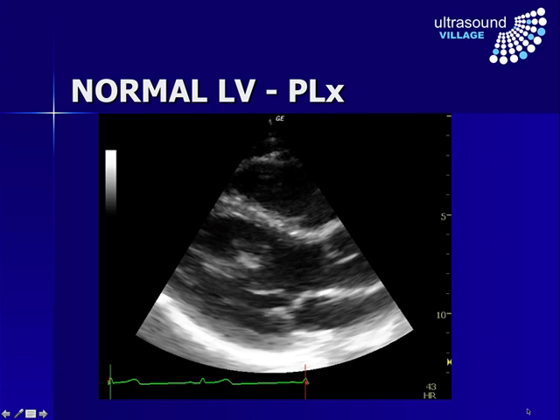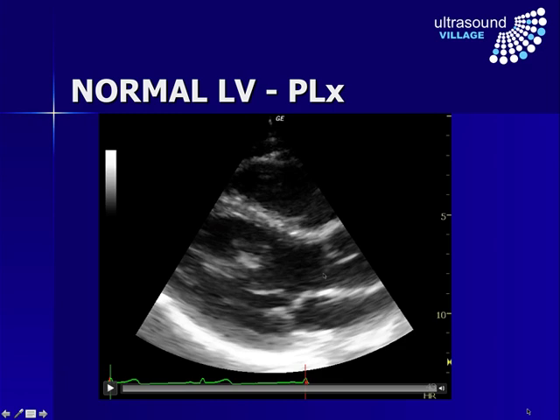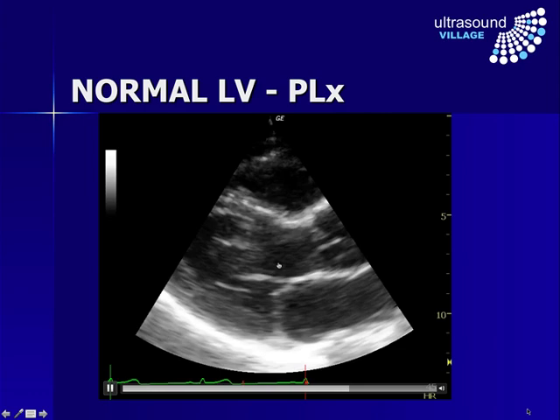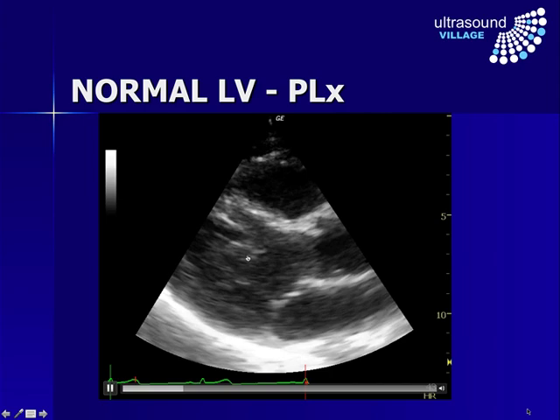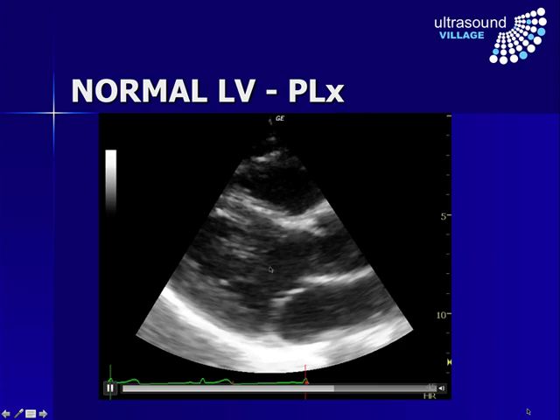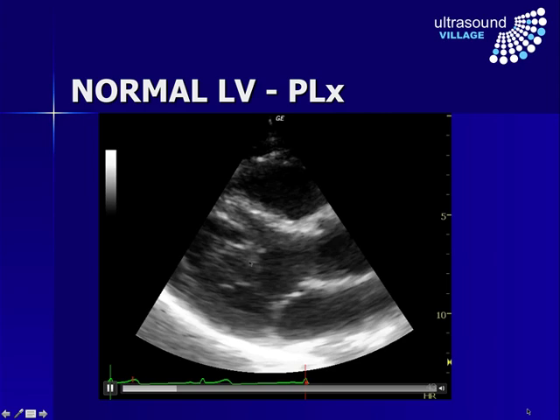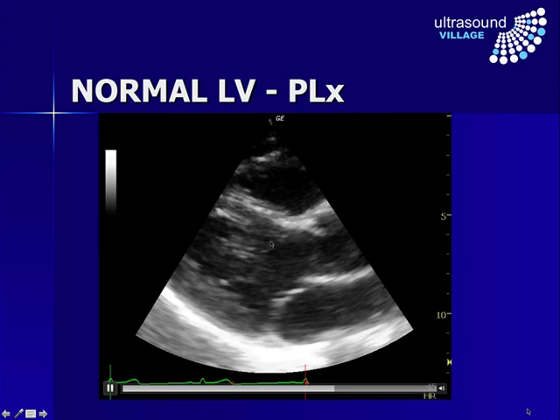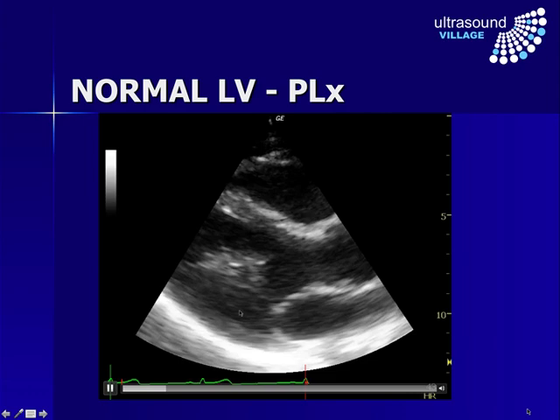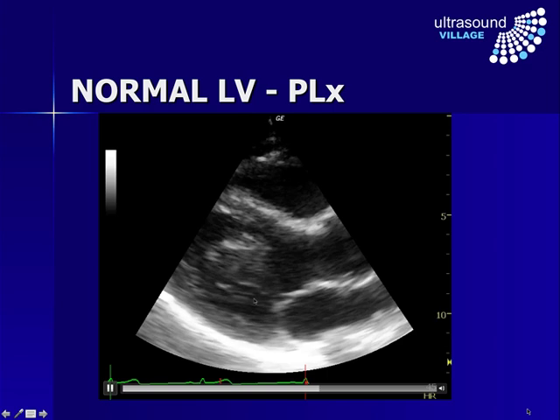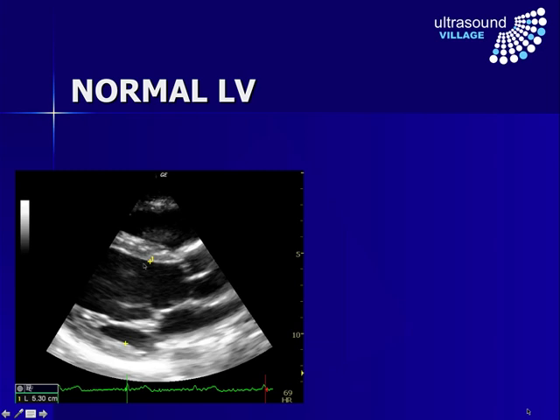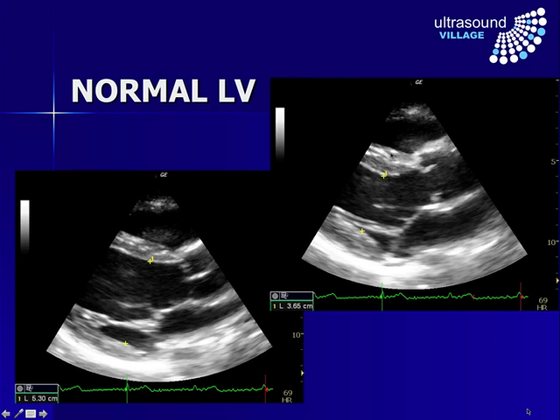Here we have a parasternal long axis from a normal left ventricle. We have the right ventricle, the left ventricle, the mitral valve, and the aortic valve. We can see the reduction in cavity size. There's a little artifact sitting in the middle of the cavity — don't worry about this, it's some side beam artifact from the edge of the wall. We normally eyeball it at around the level of the chordae tendineae, near the tips of the mitral valve. Taking a measurement: here is the diastolic measurement at the greatest excursion of the cavity, and here is during systole — you can see the walls have thickened and the cavity size has reduced. Looking at those measurements, it's around about a third.